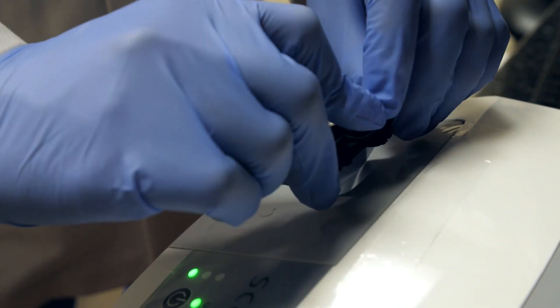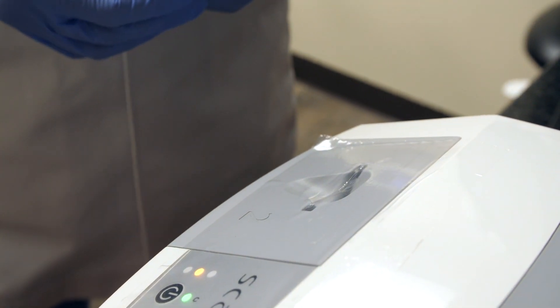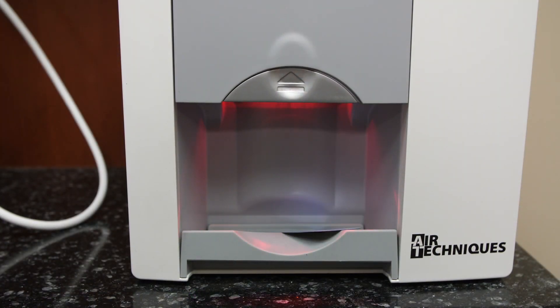For me personally, the ScanX is very easy to use. There's a minimal learning curve, and it's seamlessly integrated with my existing workflow. If you're transitioning over from other technologies, such as film or sensors, the ScanX offers a very familiar workflow.